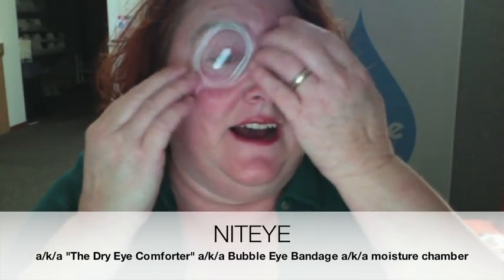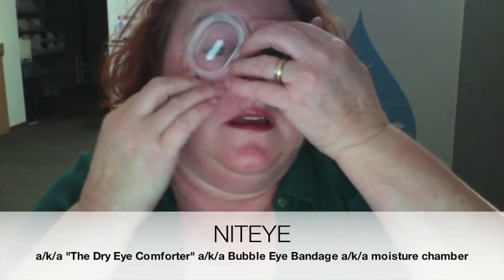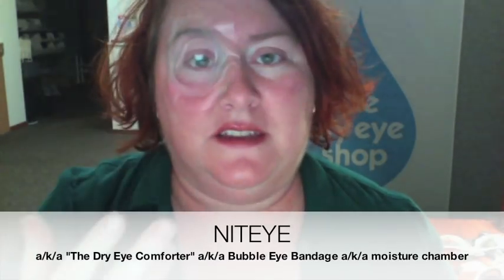So this is the Nite Eye patch. These things are expensive and awesome — it's an extremely popular product for a reason. It just does an amazing job because you've got the solid plastic bubble that vaults way high over the eye. Nothing can touch the eye.